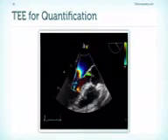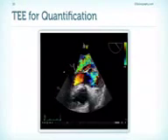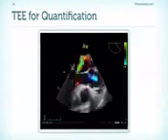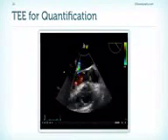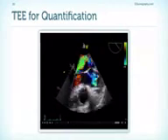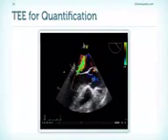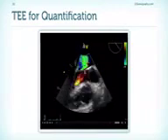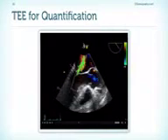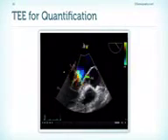How helpful is transesophageal echocardiography? This is a very nice image where you see the aortic regurgitant jet, which is pointed towards the anterior leaflet, and which actually moves this direction with the opening of the mitral valve. You can see the flow convergence zone here again, and the vena contracta. Now those images are very good and of course very helpful, but TEE is not always necessary to quantify aortic regurgitation, and there are a number of limitations.